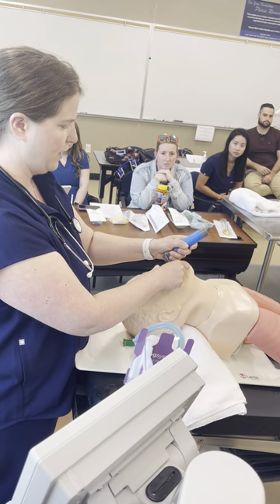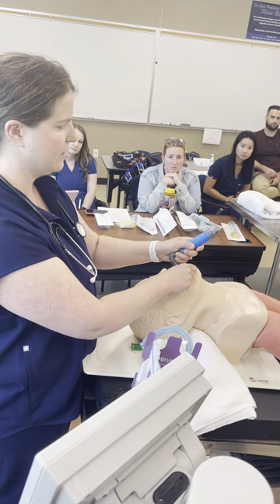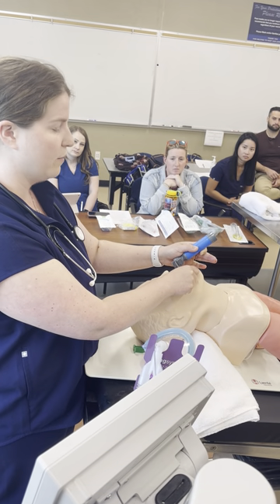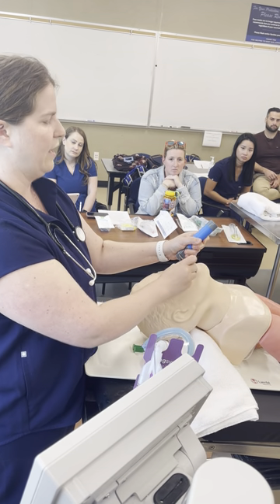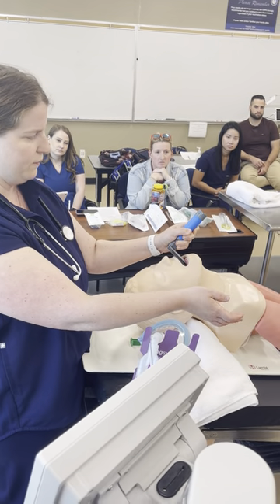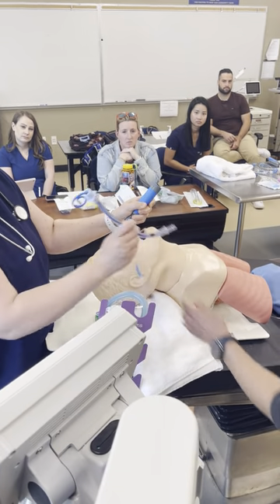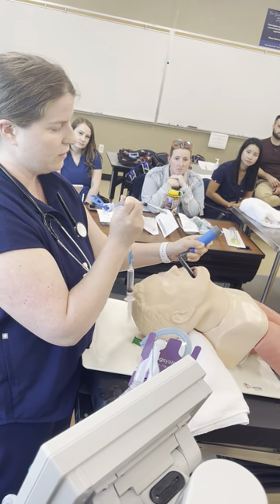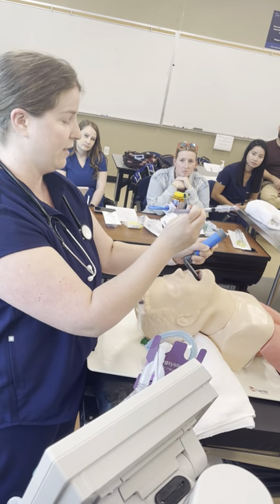Hard palate, soft palate, I see the epiglottis. I'm using a Miller blade so I go underneath the epiglottis and lift — I see the cords. Please pass me the tube. When you have your view of the cords, do not take your eyes off of them, because your hand will follow your eyes.